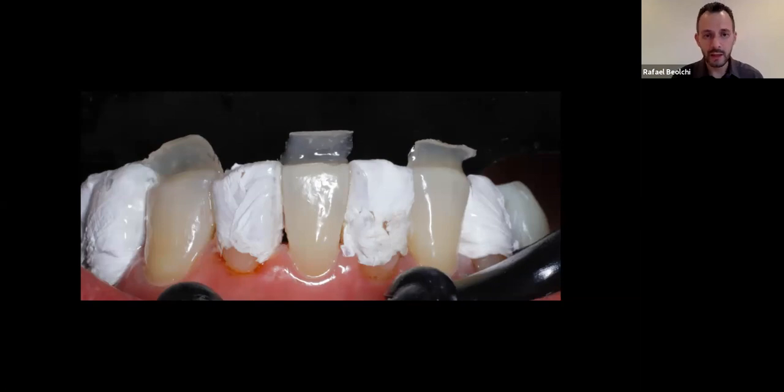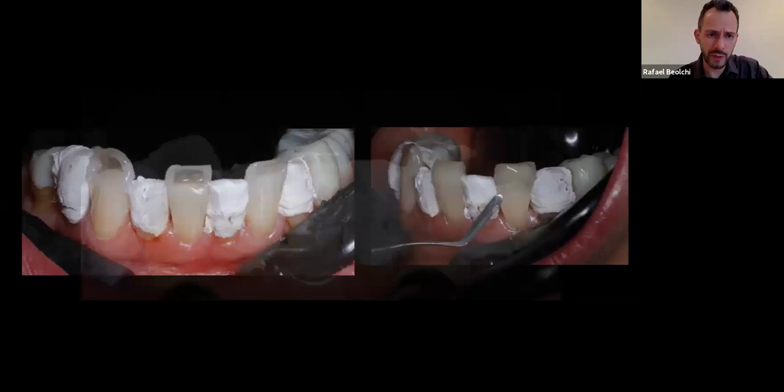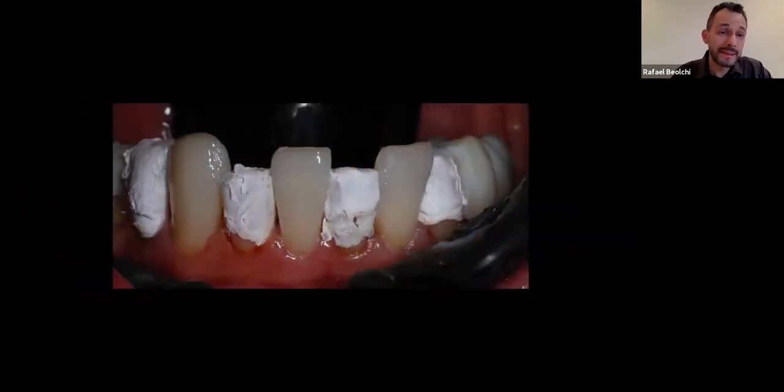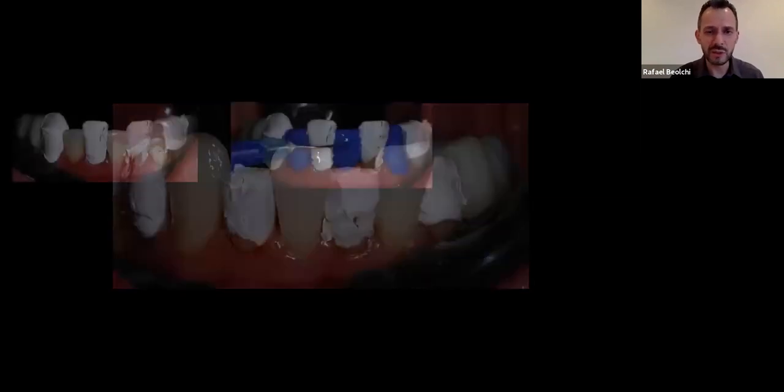Okay, it will be there. But again, it is really tall. Same thing: lingual, in this case palatal or lingual, proximals, dentin, enamel. Okay, so no big deal. Even simpler to do that. We need to rely on good composites. The composite that I used in this case is Mosaic. I know it is available here in Europe, pretty much in most countries here in Europe. Depending on which country you are in, Mosaic is not available. So it is available in the US and Europe, if I'm not wrong. Maybe some portions of Asia, I'm not sure about that.